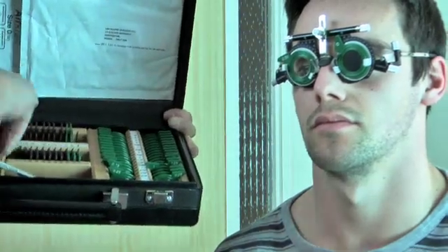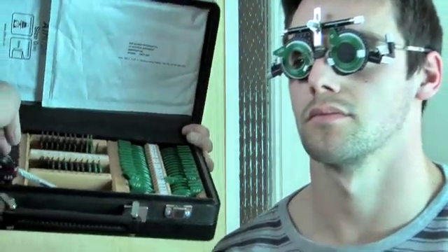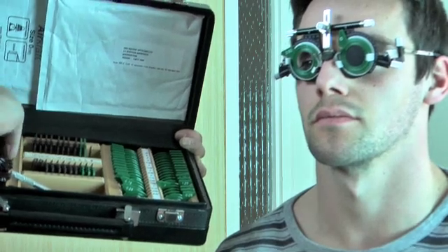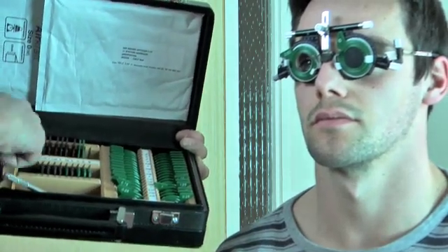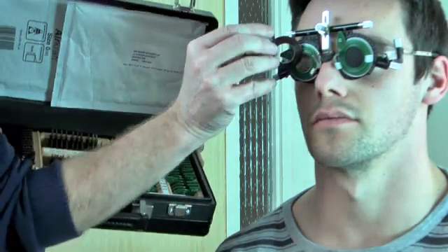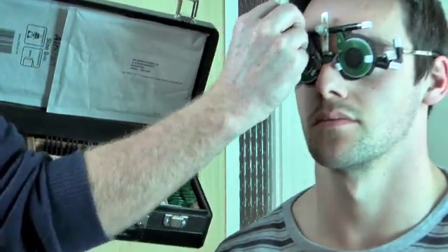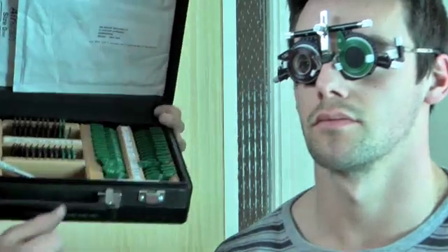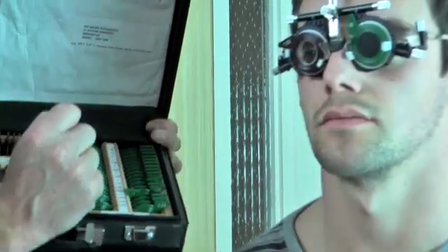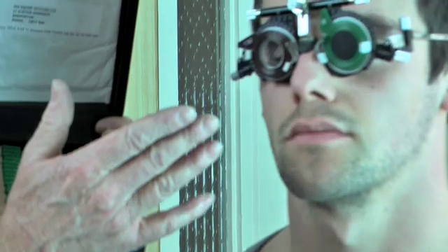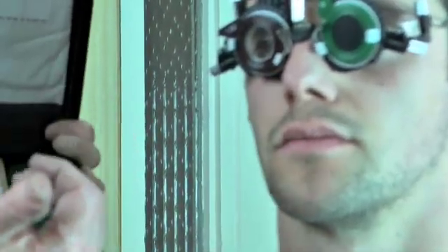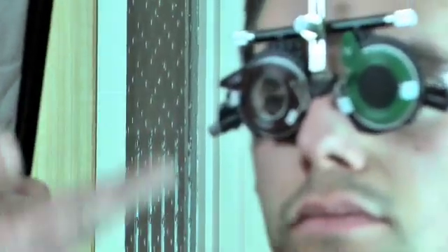So we put the minus 1 back, and then we can try a minus 1.50. So we go up by another 0.50. We put 1.50 in there, and then we say, is that better or is it worse? And if they say it is better, then you can continue to add more minus.